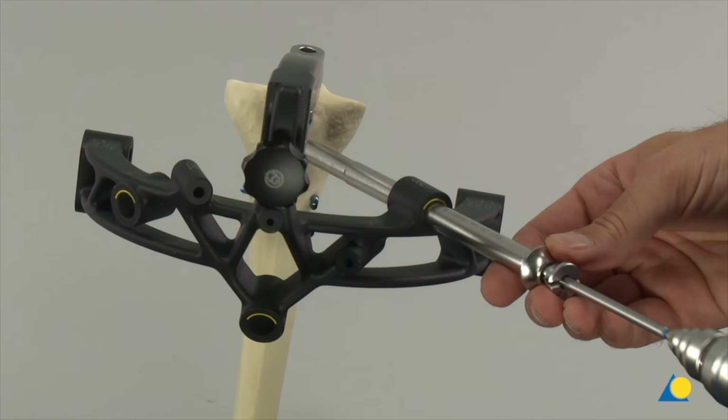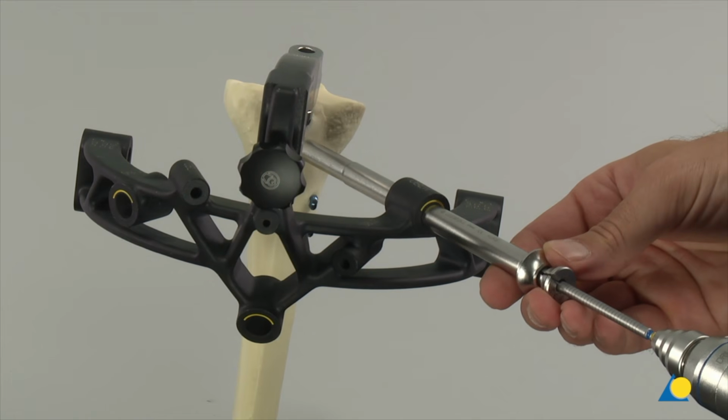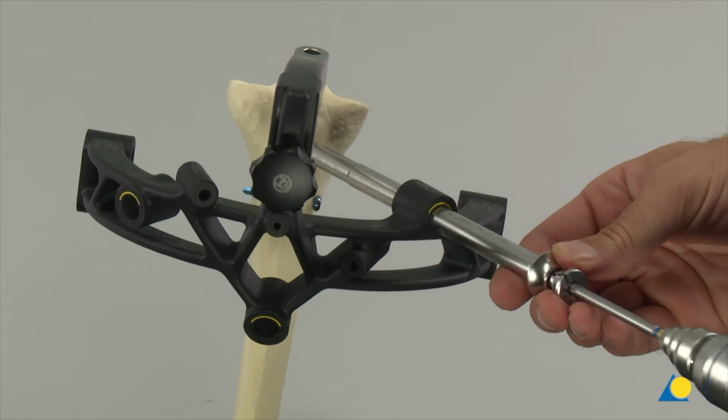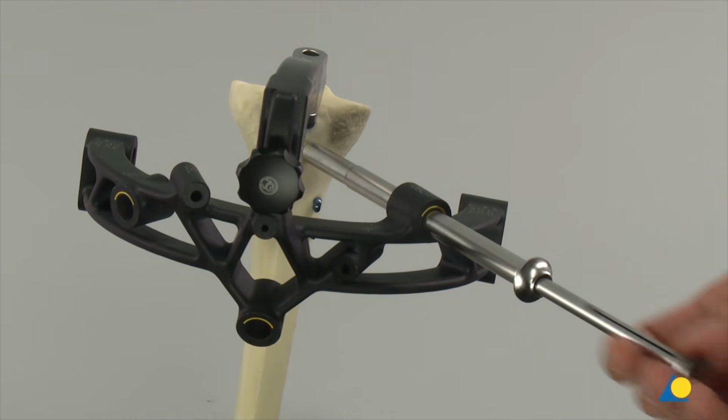Clinically, the position of the drill bit is monitored with image intensification. To do this, the image intensifier is oriented perpendicularly to the drill bit. The desired depth is drilled. A long cancellous bone locking screw will obtain better purchase in this cancellous bone. After drilling has been completed, the drill bit and drill sleeve are removed.